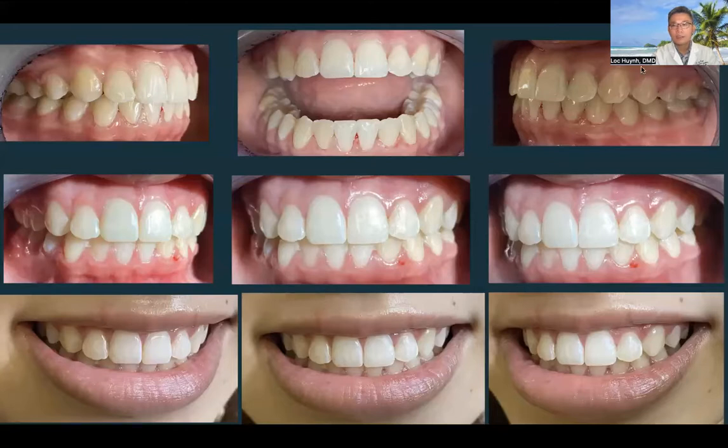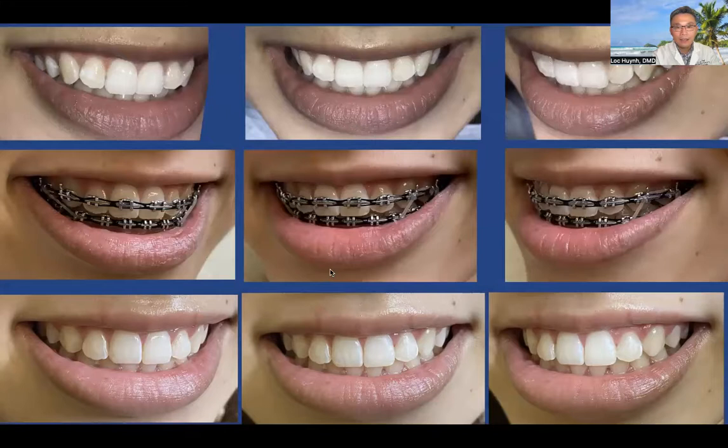Checking this out, you can see from this after treatment, I will show you the before and after, that the patient now can smile with full expression of bottom and top teeth together. The bottom teeth are straight now, and the rotation of all those incisors has been corrected. Okay, so here is the before and this is after. You see how much expression the patient shows. The total smile has been expressed.